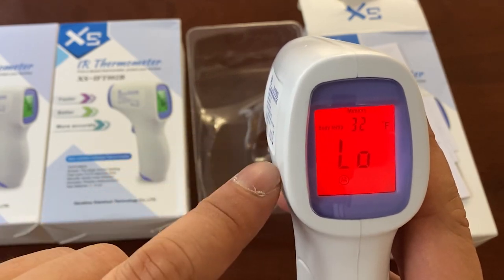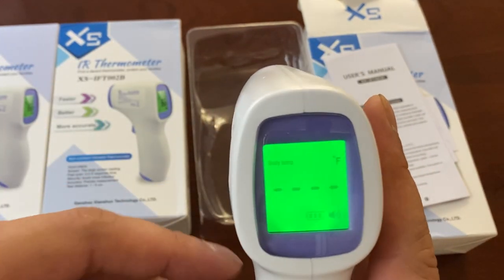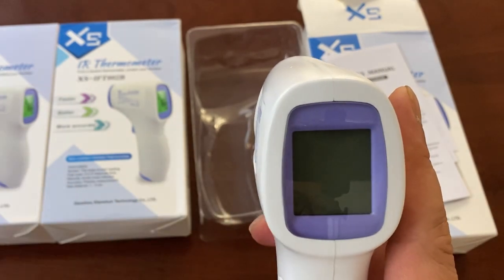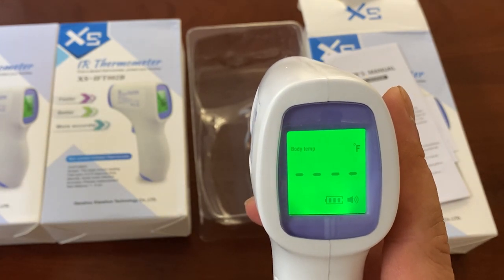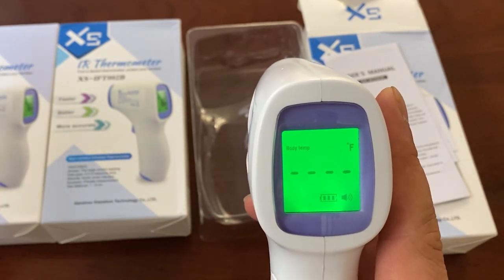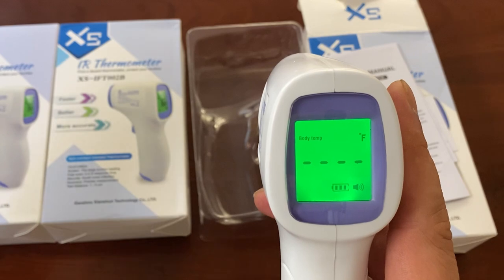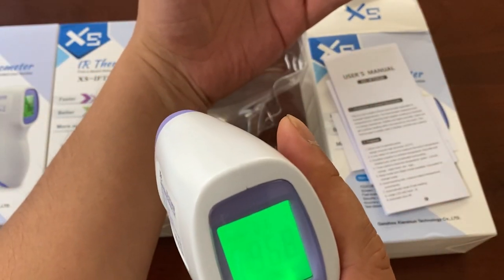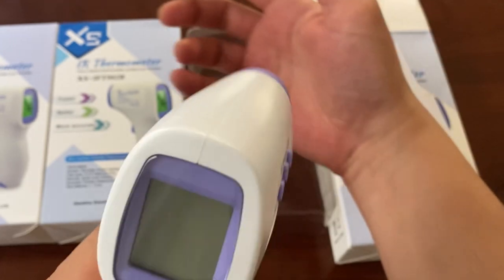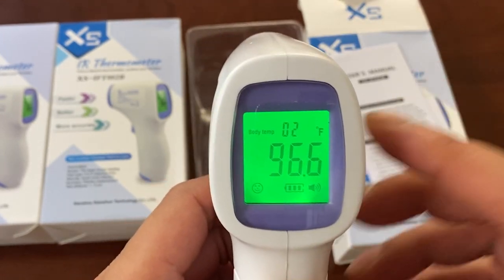Now the reason it's showing 'low' is because I've just been pressing it and shooting against the desk and boxes, which won't have the optimal temperature. Most people will shoot these on the forehead — I'm sure you've seen it on the news and social media. People are aiming these at foreheads to get temperature. But you actually don't have to; you can aim it at your wrist, like so. See that? 96.8. Let's try my right wrist — 96.6. It's pretty accurate.